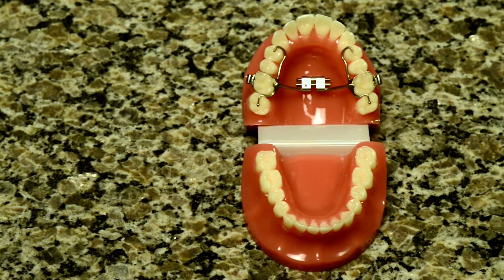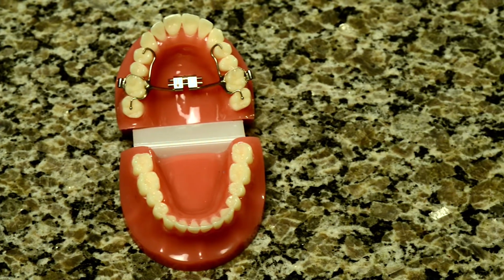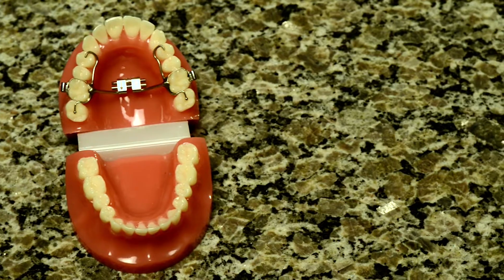You may also notice that you are producing extra saliva. This is because when we put something in your mouth, our body thinks that it's food, and it creates saliva in order for us to swallow or digest. In a few hours, maybe even a day or so, your body will realize that this RPE is not food, and the extra saliva will stop.